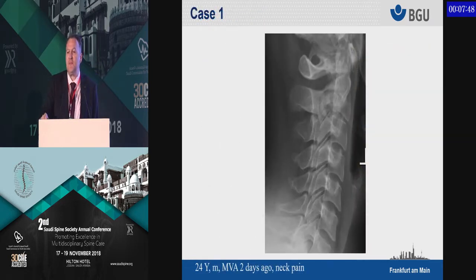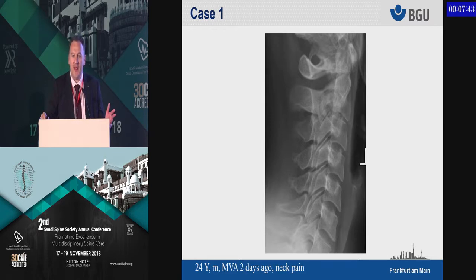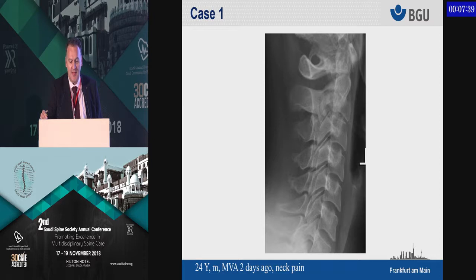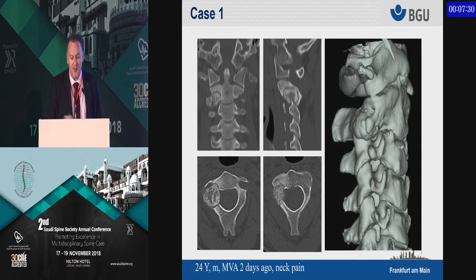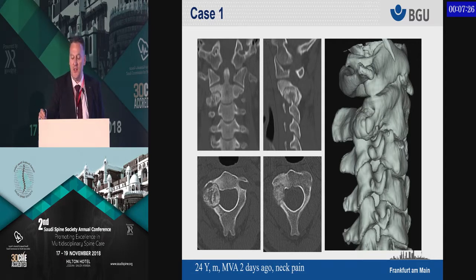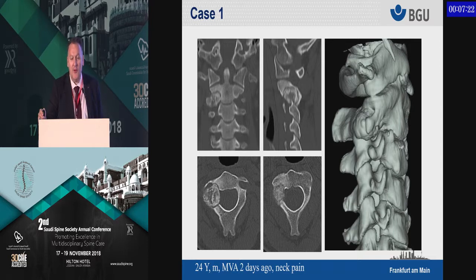Let's have a look at some cases — when do we use fluoroscopy navigation versus CT navigation? A case of a 24-year-old who had a motor vehicle accident two days ago with neck pain. If you look closer, something is obviously wrong, and if you do a CT scan you incidentally see a tumor — which most of you will already know is a benign tumor.